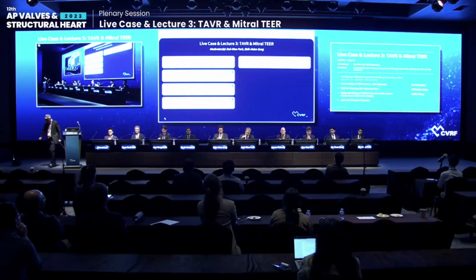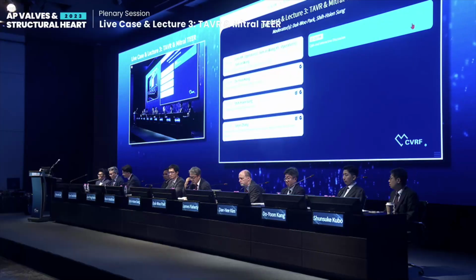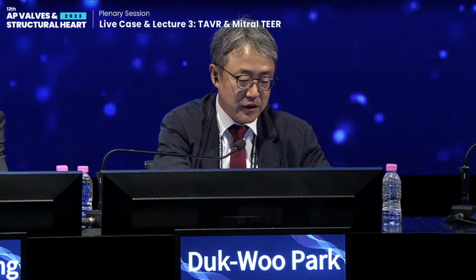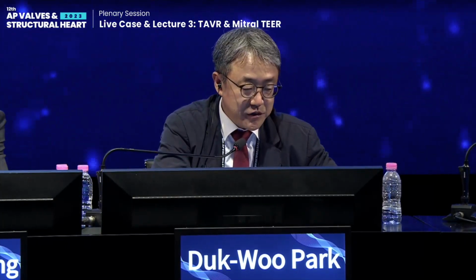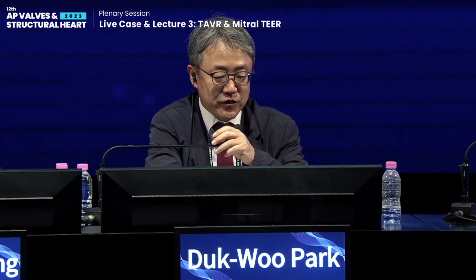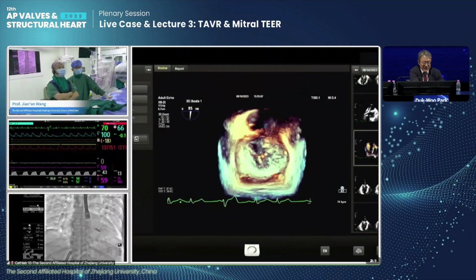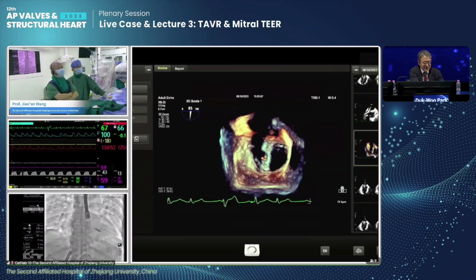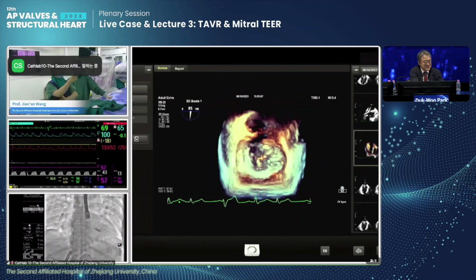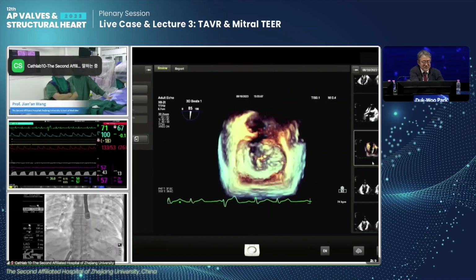Thank you, Professor Zhang. And for the discussion, Professor Wang at Zhejiang University is waiting to show the final result. Okay, Dr. Liu, can you show the final result? Okay, sure. Professor Park. Yeah, we are watching. We already finished the procedure. So this is the orientation of the device, the Dragonfly.